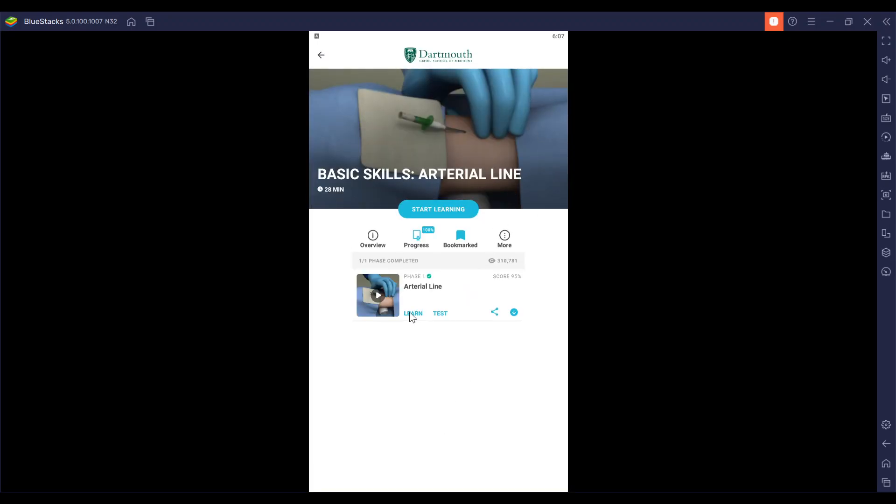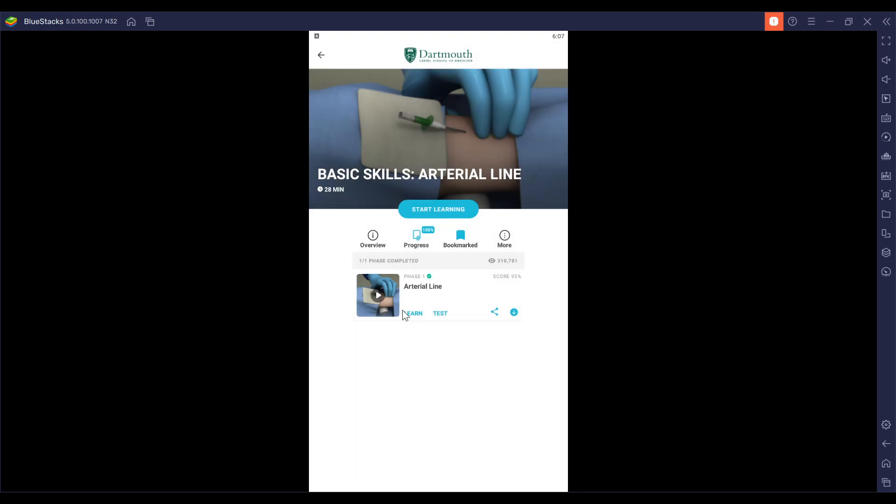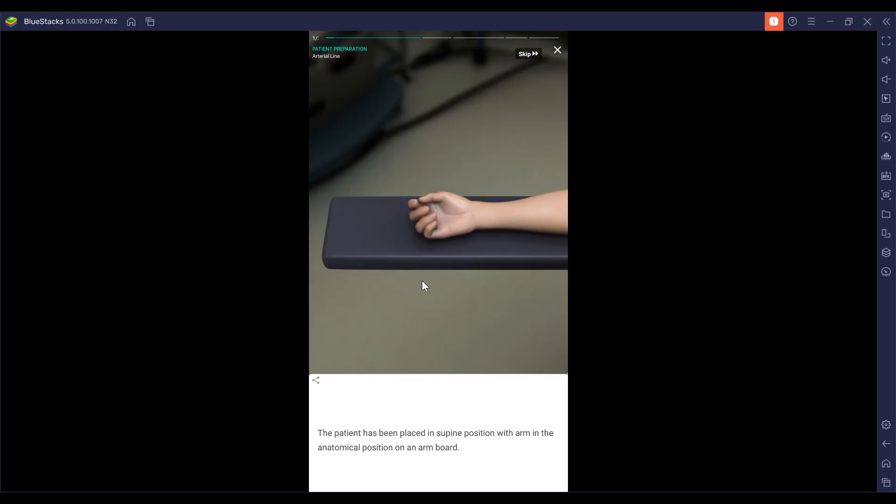We're going to begin. The first step to patient preparation is to lay the patient in the supine position with the arm in the anatomical position on the arm board.